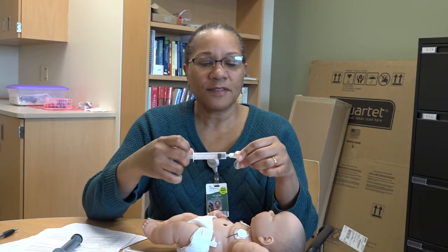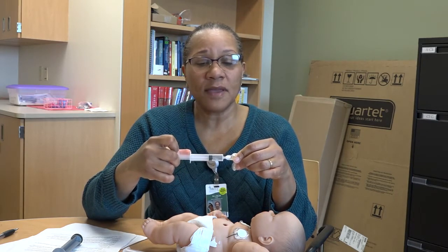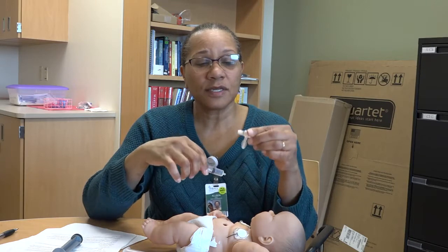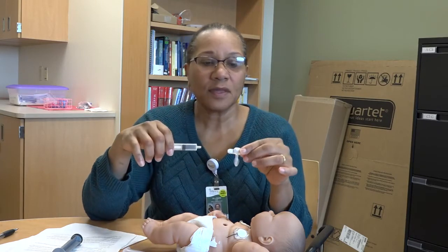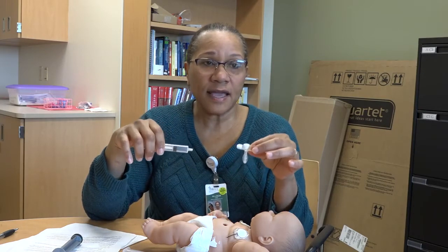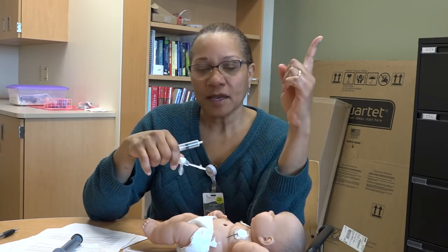And so if that is the case, it very well may be that your balloon has lost some of the water that's inside of it, okay? And so if that's the case, let me back up a little bit.